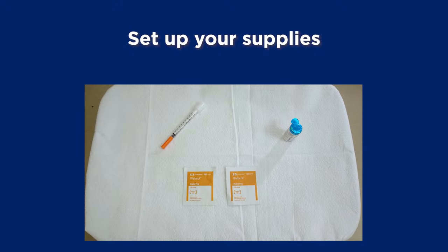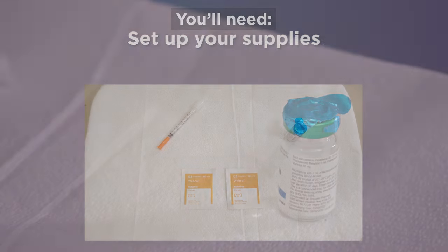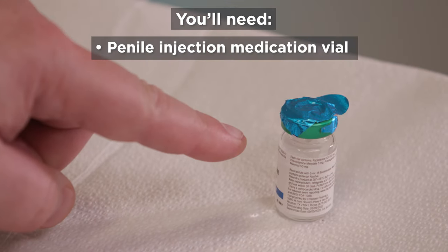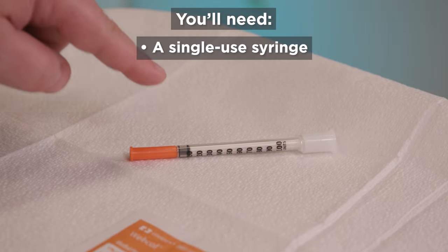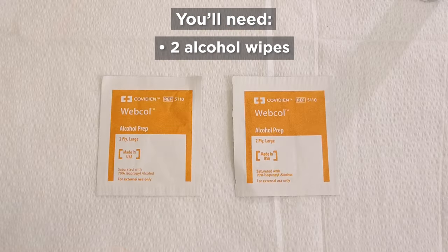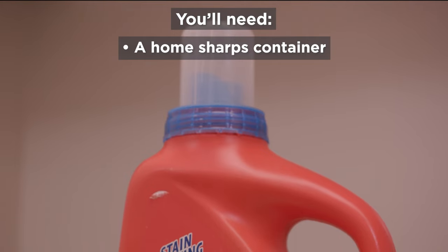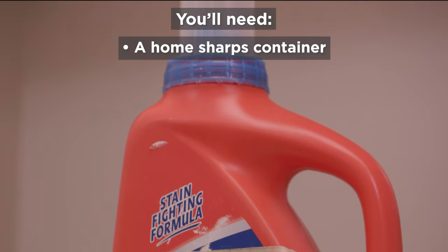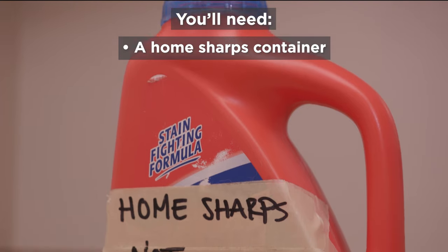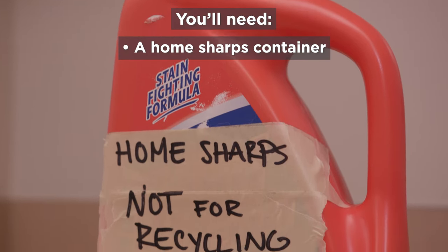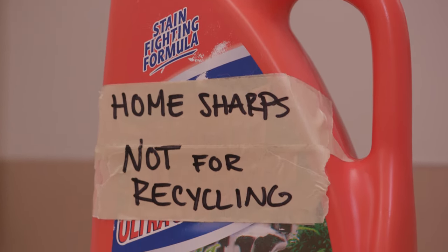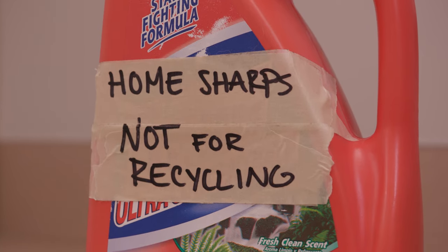First, set up your supplies on a clean surface. You'll need your penile injection medication vial, a single-use syringe, and two alcohol wipes. You'll also need a HomeSharps container to hold your used syringes. You can use an empty hard plastic container with a screw-top lid, such as a laundry detergent bottle. Label it HomeSharps, not for recycling.